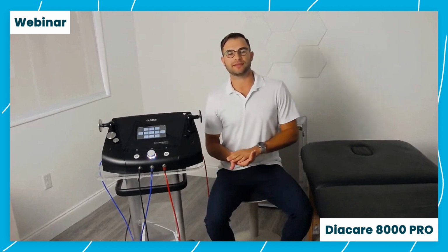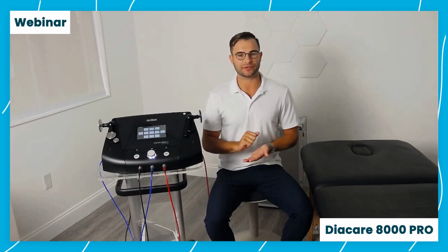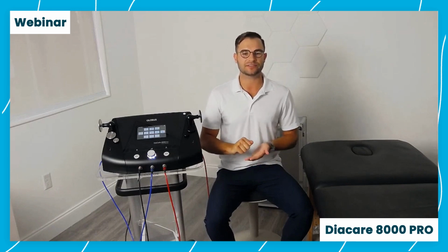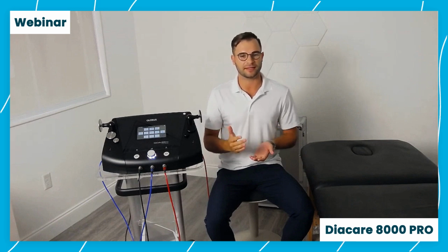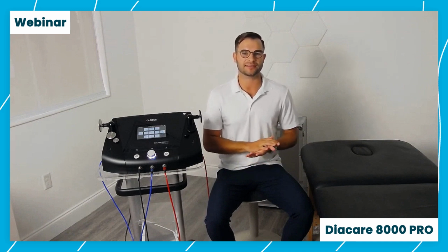It's important when thinking of Diacare therapy to compare the difference between a capacitive and resistive ways of delivering the waves throughout the body. We're going to be targeting different things. So if we start on the capacitive side, we're using an insulated active electrode, and the patient is going to find that the heat is going to be local to the head of that electrode. Therefore, we're targeting more of the superficial tissues, those very close to the surface of the skin, including the surface of the skin as well. This is going to improve things like blood circulation, increasing tissue elasticity, reducing pain, as well as swelling in those targeted areas, again, superficial to the electrode.